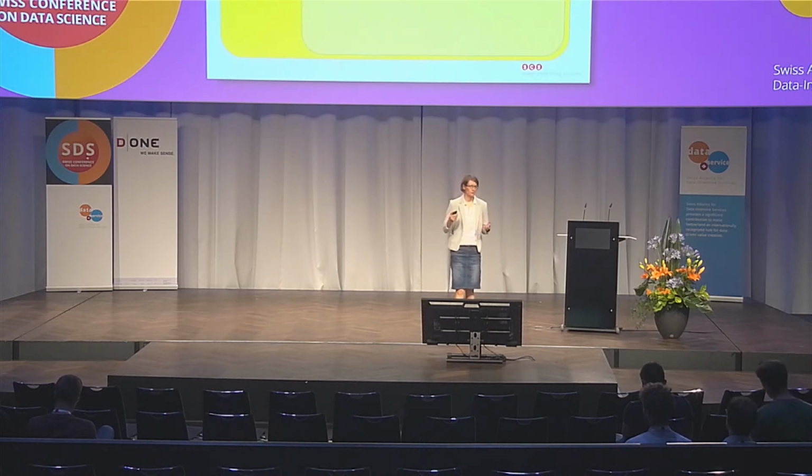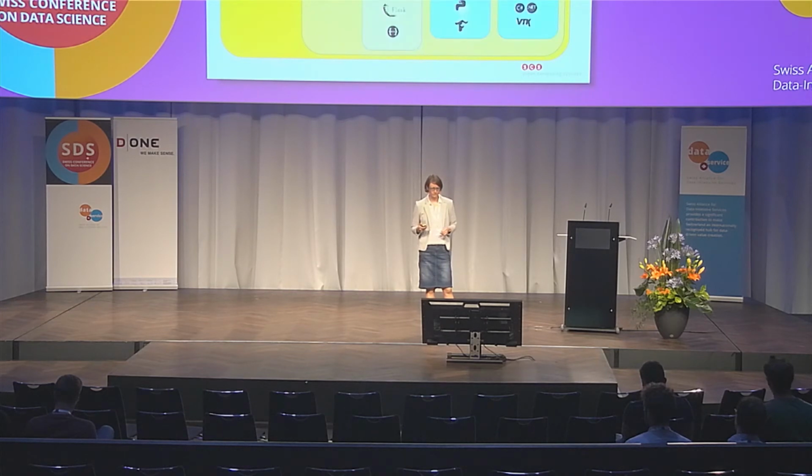Then we containerized it such that it is easy, if we want one day to change away from Azure Cloud, we can easily deploy it on a different system, so we used a Docker container. And then we had 3 components where the OCT service basically provides this REST API to the segmentation and analysis services, which are easily accessible.